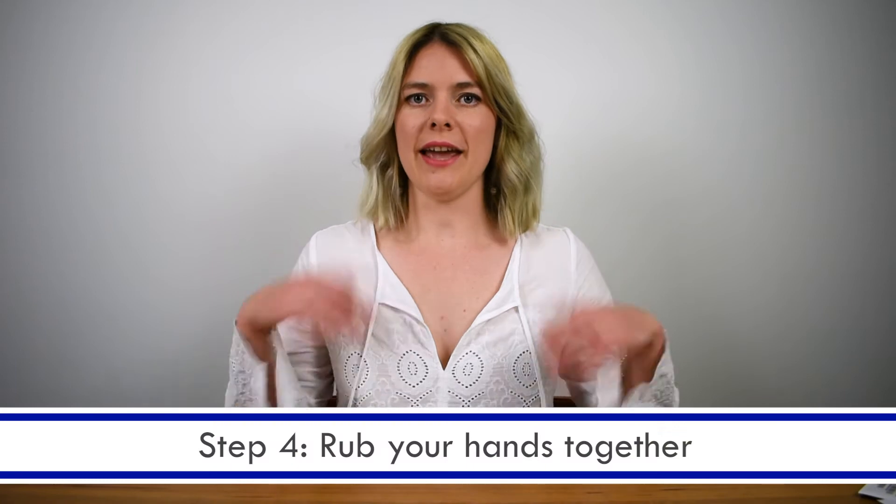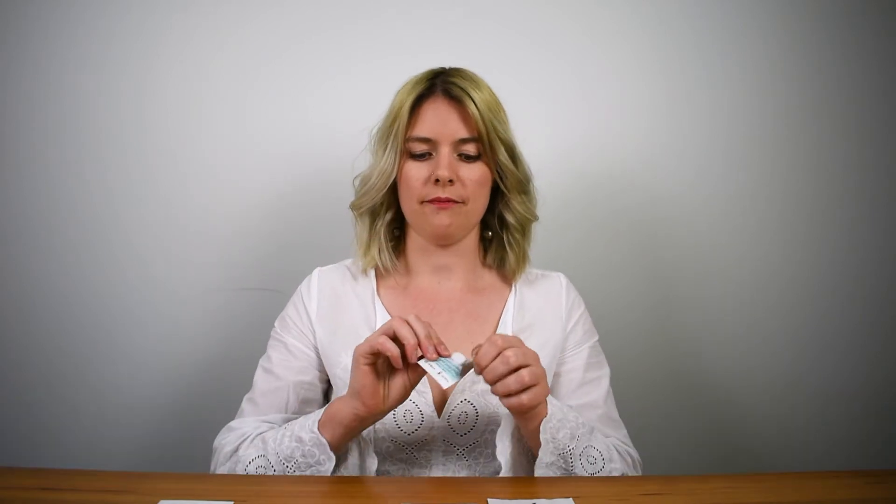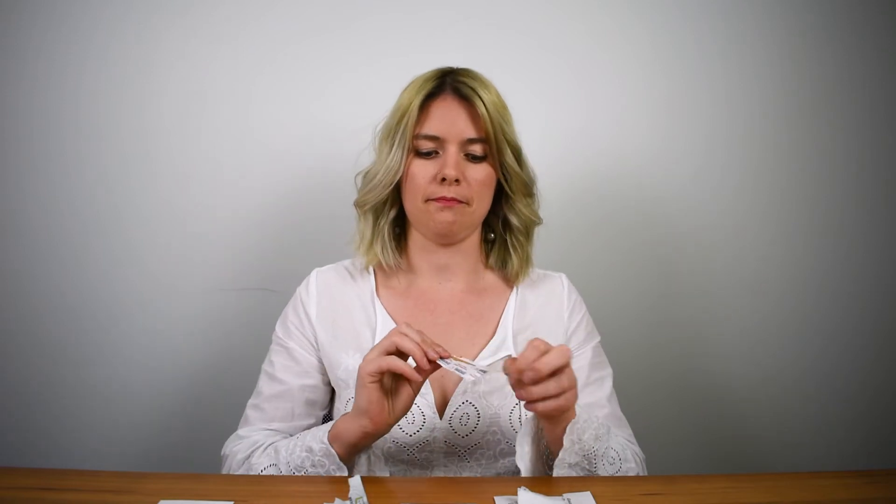Step four: give your hands a shake and rub them together to help stimulate blood flow. Step five: open up your alcohol prep pad, open up your gauze and one of the band-aids, and place these in front of you so that they're ready to use.